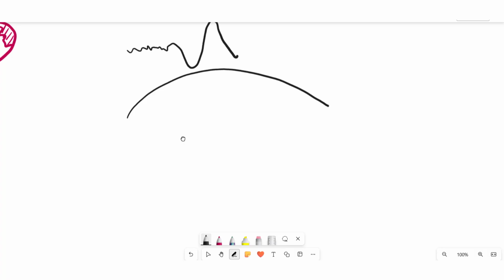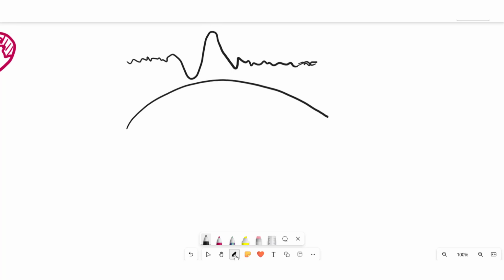All right. When we look at the surface EEG, suppose it is the skull of a person, and here we have a K complex happening, and beneath the surface we have some neurons which are called pyramidal neurons.